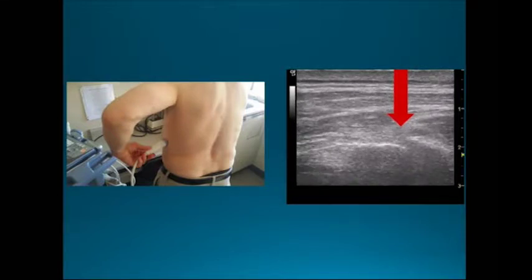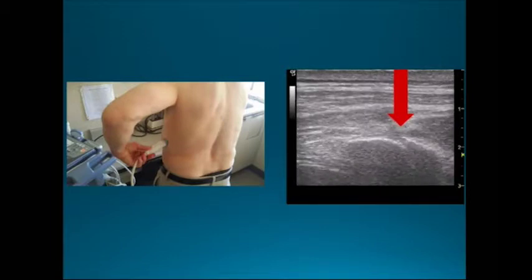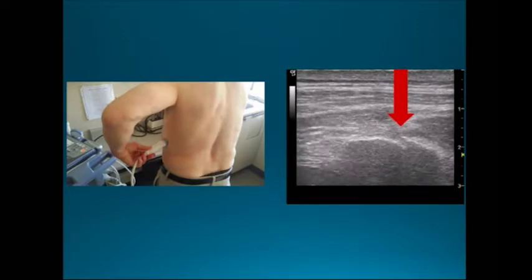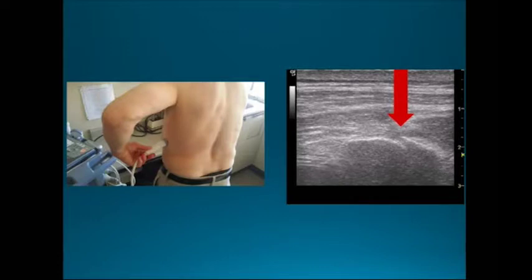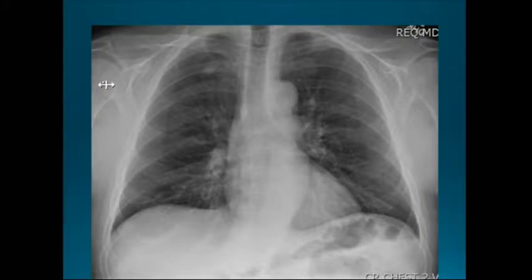Who wants this rib? Nobody wants this rib, right? I look at this, and this makes me cringe every time I watch it. I just take a deep breath, and he's like, oh! That is a rib fracture. That's how you can diagnose a rib fracture using point-of-care ultrasound. And this is a very normal chest x-ray. He even had a rib series that was normal and things like that.